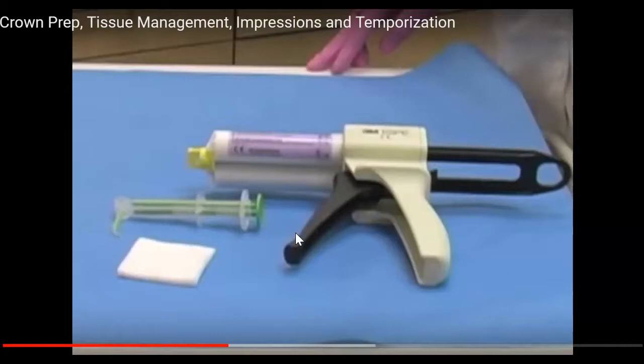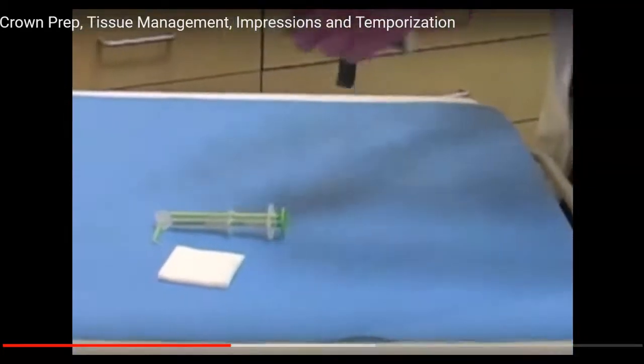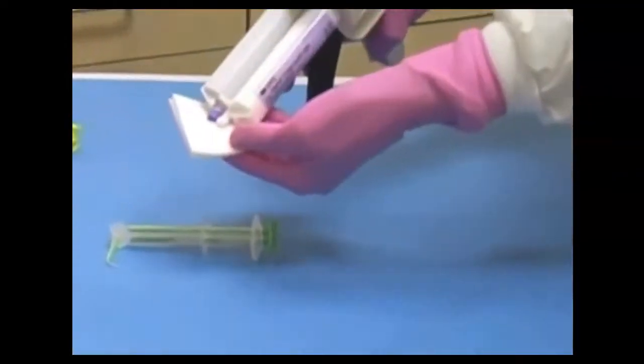And then they dispense a little bit of that material as well onto the tray before they take the final impression. So prior to the final impression, the retraction cord is removed and the final impression is taken. Again, she's dispensing it to ensure that it's going to mix properly.